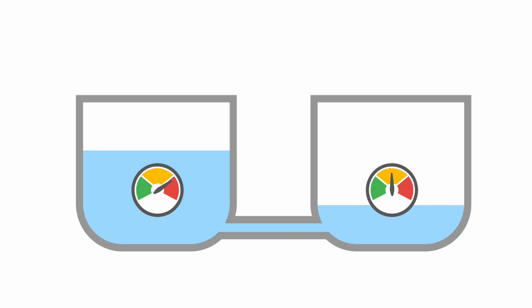Now, for a bit of theory. We know that the difference in pressure will initiate flow, and that a solution flows from an area of high pressure to an area of low pressure.